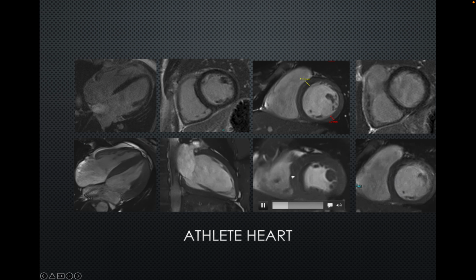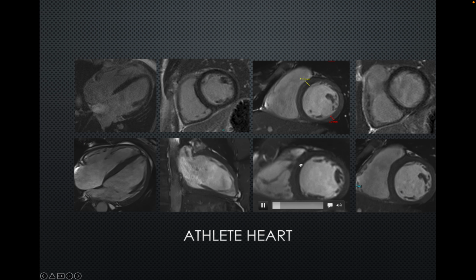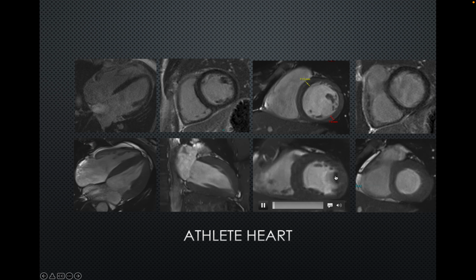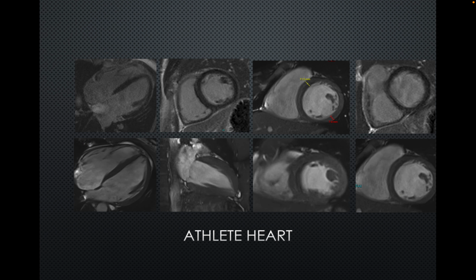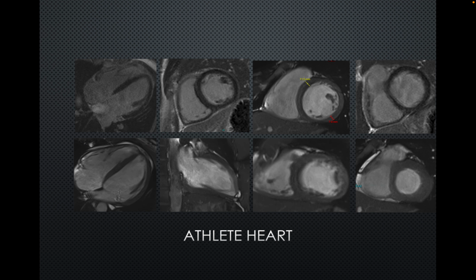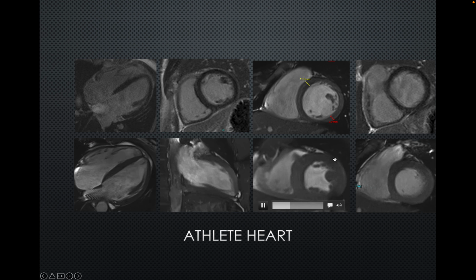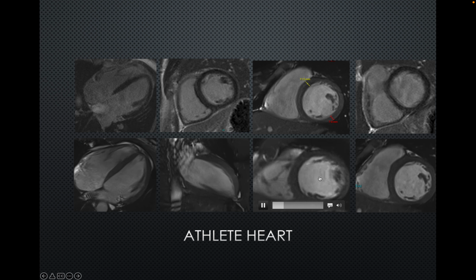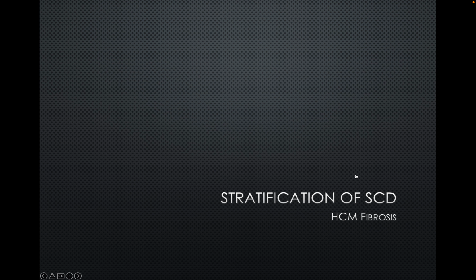Even if it's increased due to steroids or anabolic use, we could recommend stopping the steroids and anabolic abuse, and then perform a follow-up after 3 or 6 months to see the trend of regression of the wall mass and wall thickness. MRI, of course, could provide satisfactory solid numbers during follow-ups of those cases, measuring the wall thickness and the wall mass.